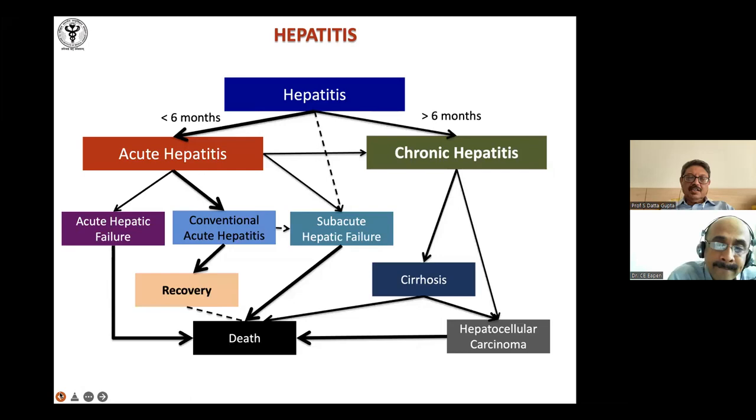You see, in a liver biopsy, which we do generally for hepatitis and other things, the mainstay is H&E, that is hematoxylin and eosin. Then besides that, we have special stains, we call them usuals. One is diastase PAS, the other is reticulin, and a stain for collagen. You do a Sirius red or Masson stain. So these four stains are generally done routinely in all liver biopsies.